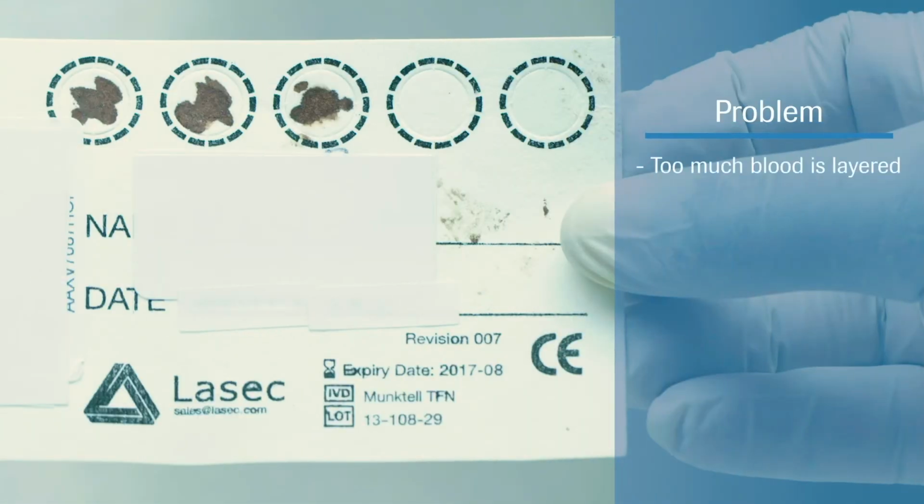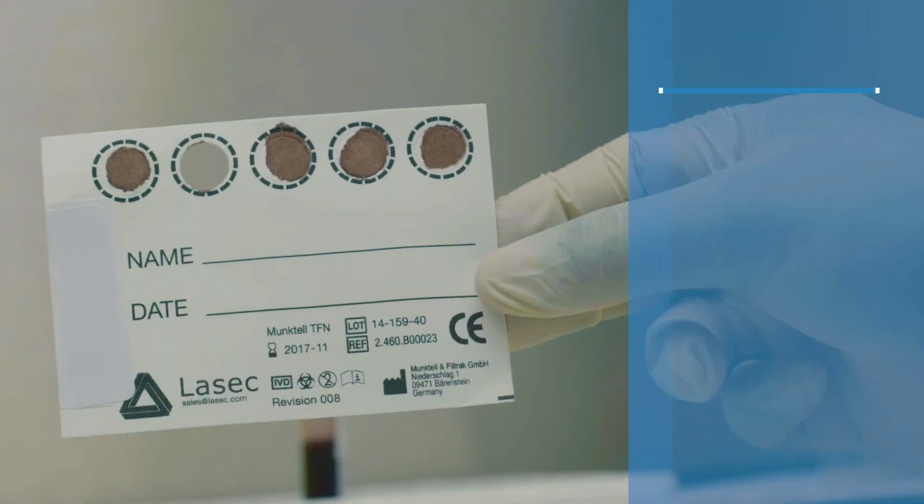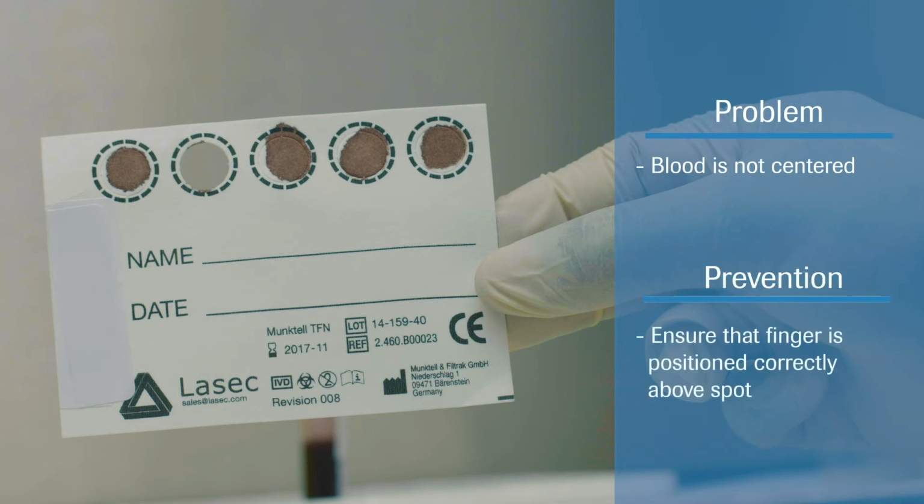If a new drop of blood is put on top of a dry drop, the spot will be layered and will not be testable. To avoid this, do not add a new drop to a drop that is already dry. If the blood spot is not centered in the lines or perforation, it may not be testable. If one of the drops is too far outside the lines, move on to another circle. You should have at least 3 testable spots on each DBS card.